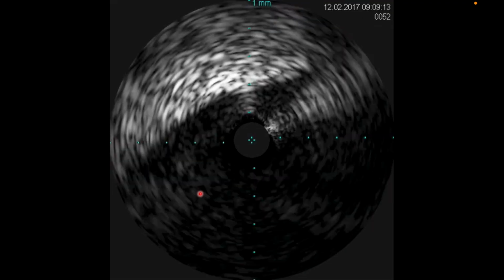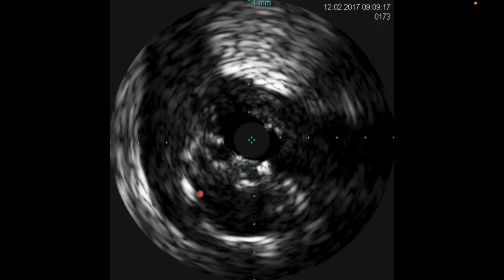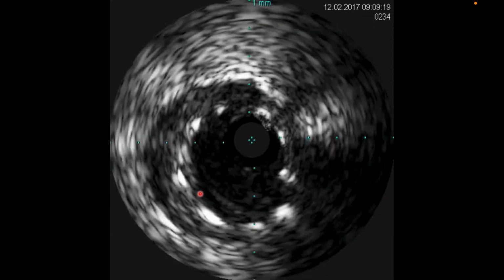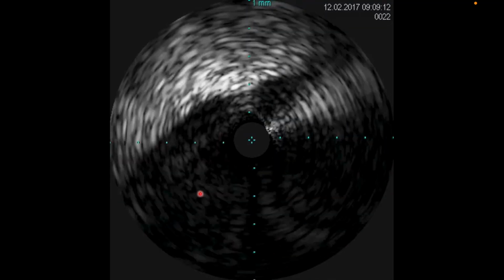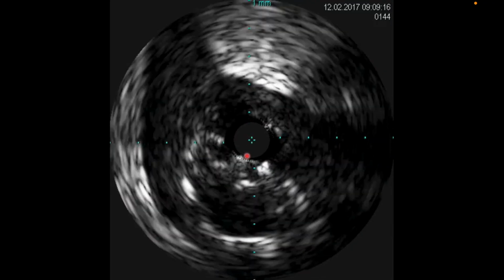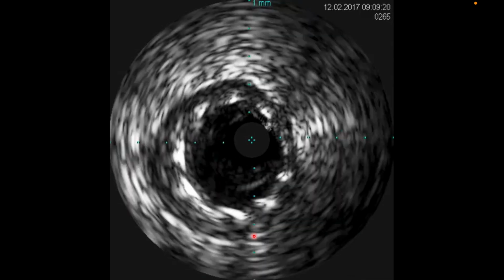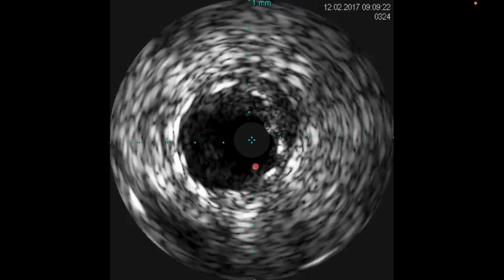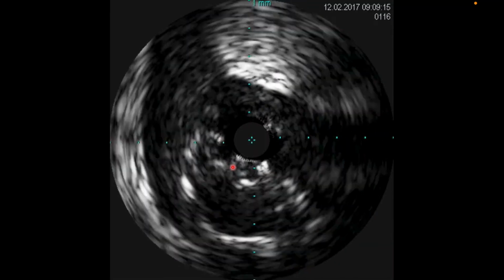So I wanted to know why this patient had stent thrombosis. So I did an IVUS study after I reached, following their ballooning, and the IVUS study was very interesting. You can see here the IVUS catheter is here, but the stent is all the way here. So how come I'm not inside the stent? Distally I am inside the stent, but in the ostium I'm outside the stent.